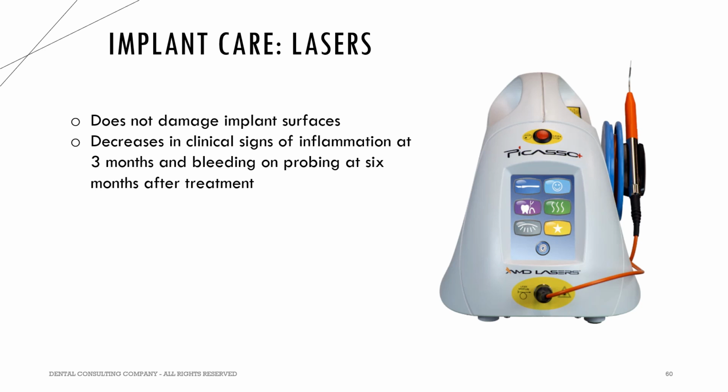Another option for your practice, if you have one, is to use lasers. They do not damage the implant surface, and they can decrease clinical signs of inflammation at 3 months and bleeding on probing at 6 months after treatment.